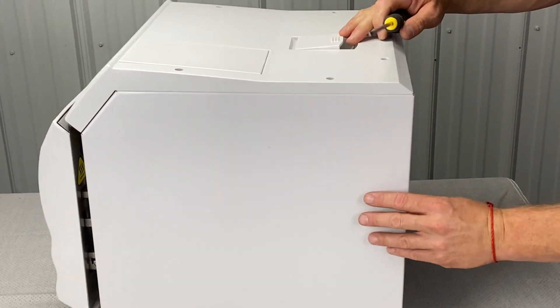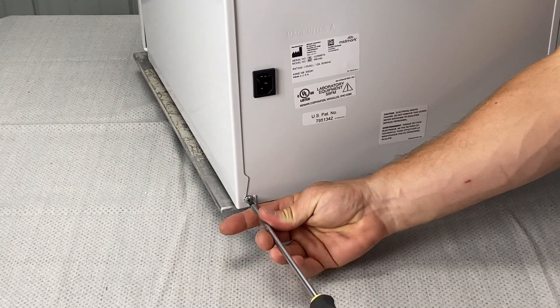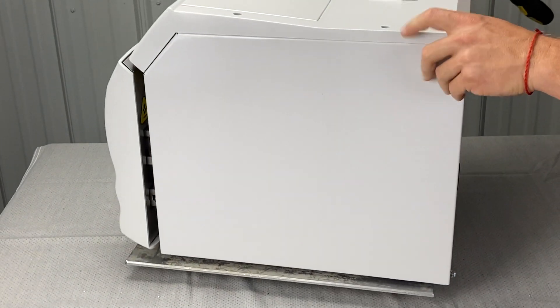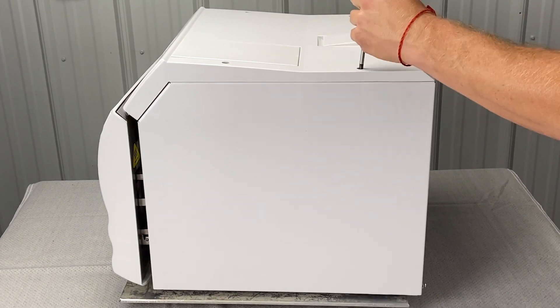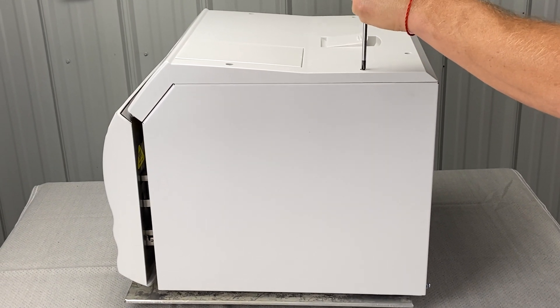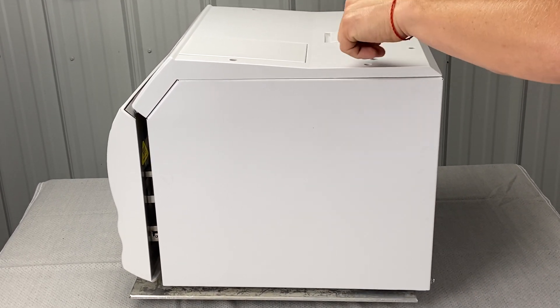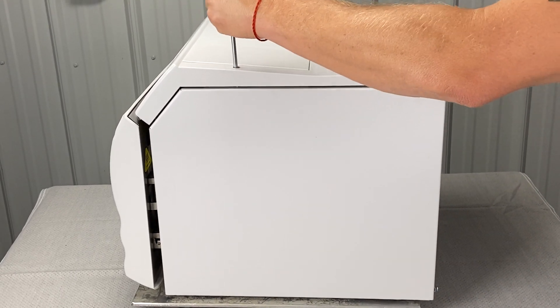Using a Phillips screwdriver, there are three screws. There's one here — we're going to loosen that one up. There's one here — we're going to loosen this one up. And there is also one right here. Keep the screws; don't lose them.